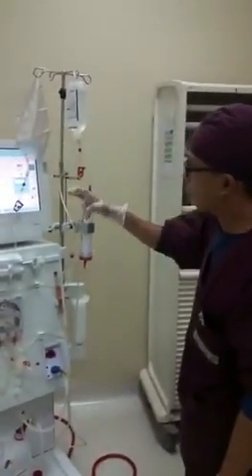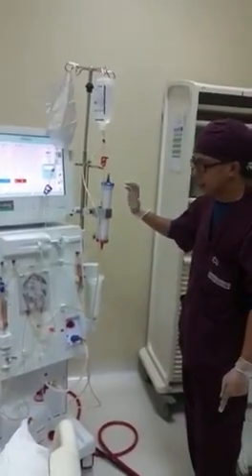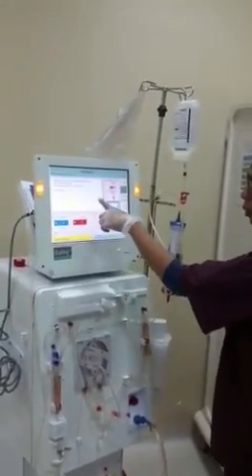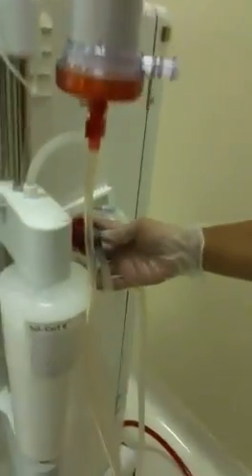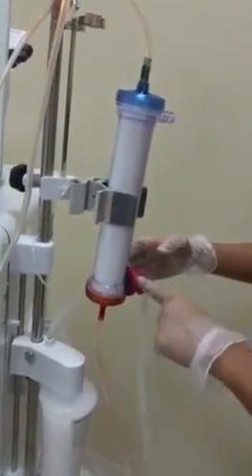After connecting everything, we will wait for the machine to connect the coupling to the dialyzer. Once this dialog box appears, connect the dialyzer coupling with the dialyzer — press, then pull. Note the color markings: red to red, and blue to blue.